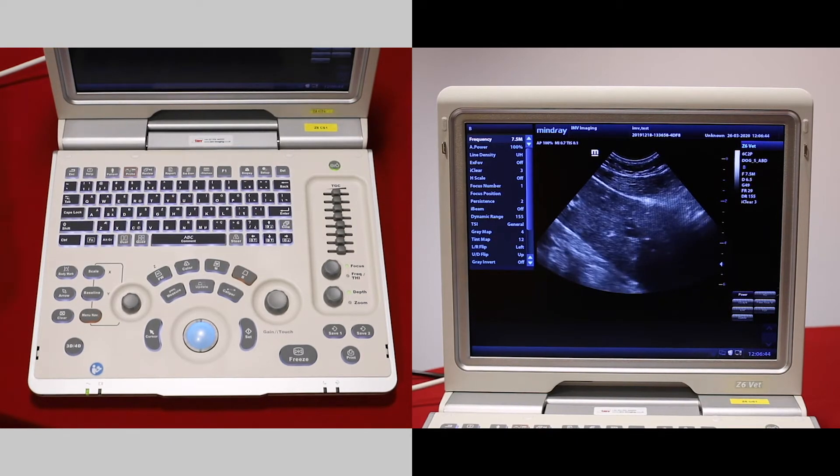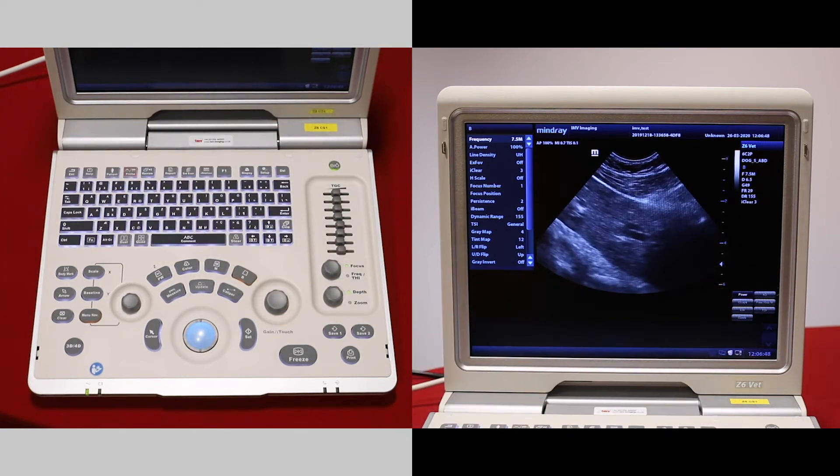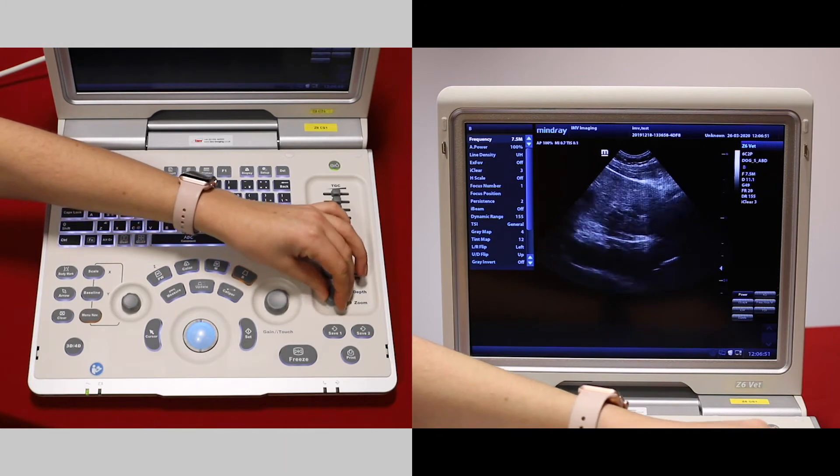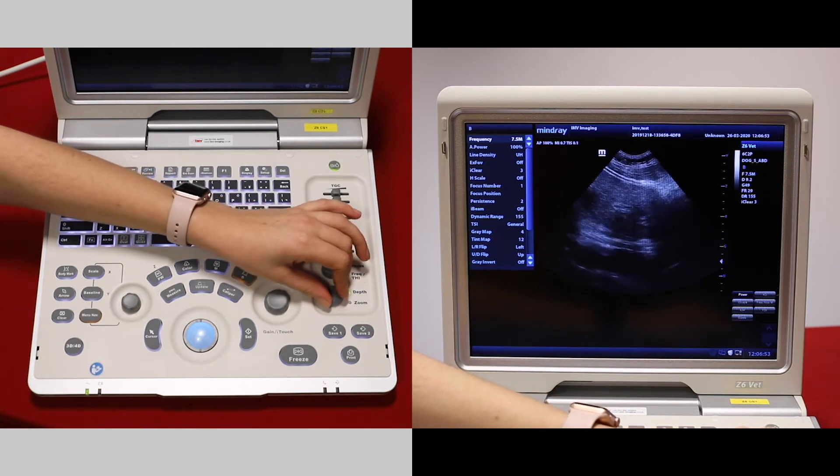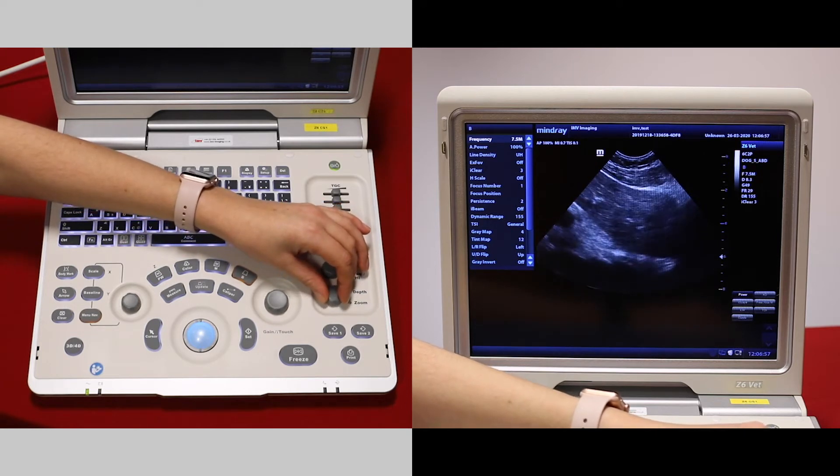To adjust your depth, twiddle this button here. A centimeter scale is on the side of the screen. You can increase or reduce your depth, but make sure that the organ of interest is taking up about three quarters of the screen.